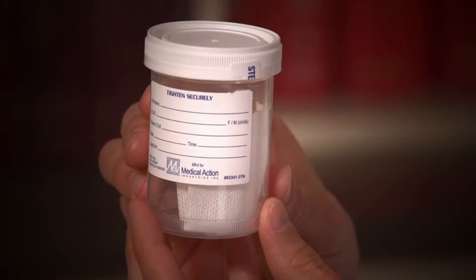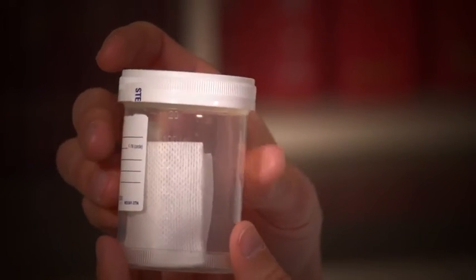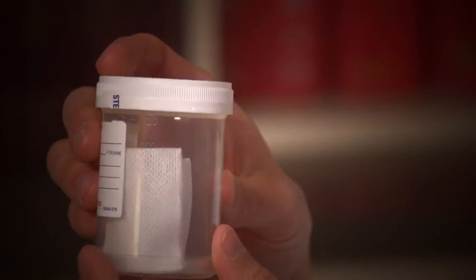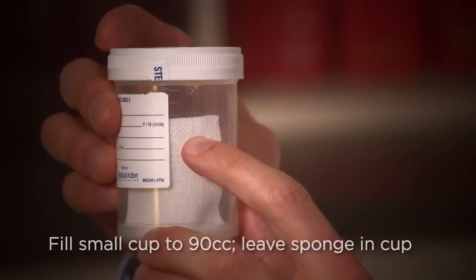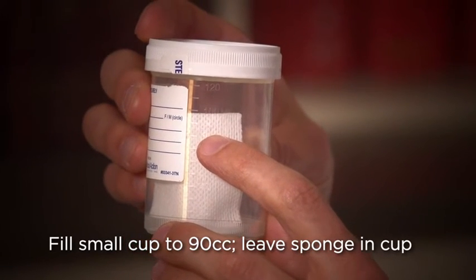Once you have recorded the volume, take some urine from the larger container and pour it into the smaller collection cup and fill it to about 90 cc's. You can see that there is a small sponge inside of the cup. It is important that you leave this sponge inside of the cup in the urine. This sponge is a preservative and it makes sure that the urine is interpretable once it has been received.